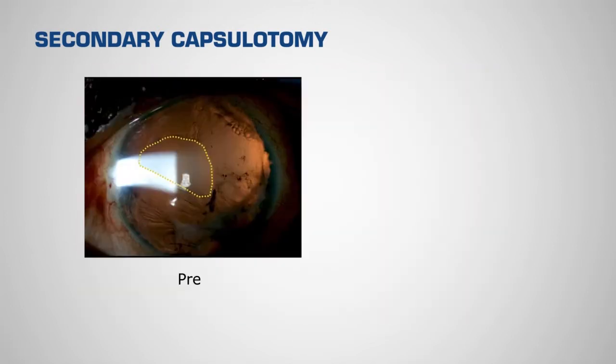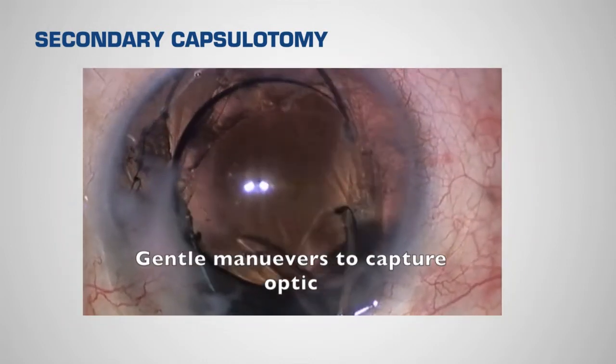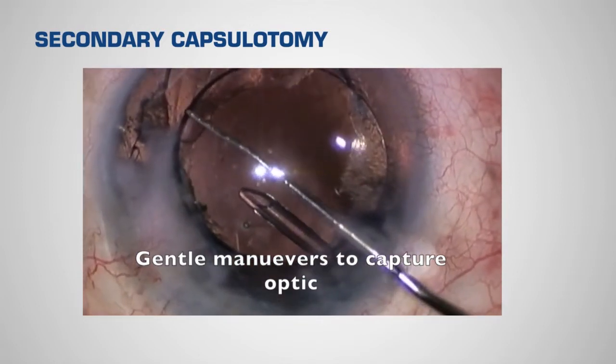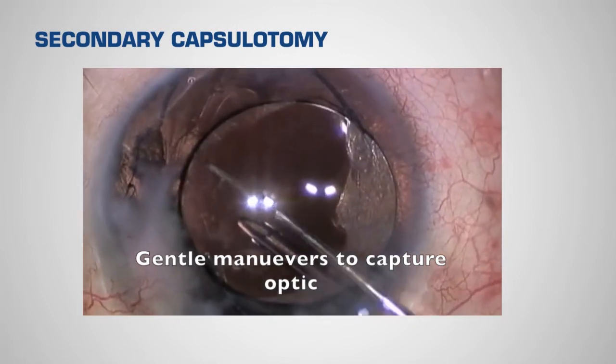The picture on the left shows the preoperative image showing an irregular anterior capsular opening with fused anterior and posterior capsular remnants. By customizing the settings on the femtosecond laser, we were able to achieve a centered and relatively circular 5mm capsulotomy. A 3-piece intraocular lens was then gently inserted into the sulcus and the optic was captured, and good capsule overlap was confirmed all around the optic.